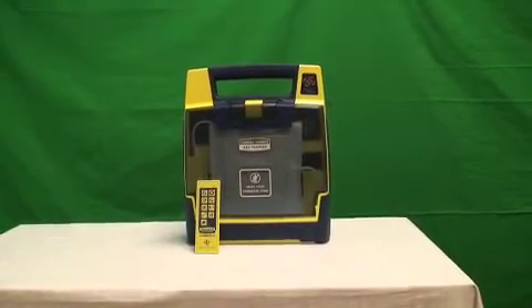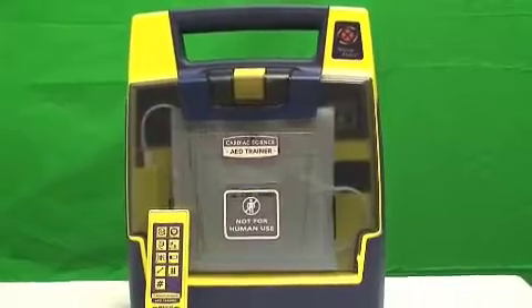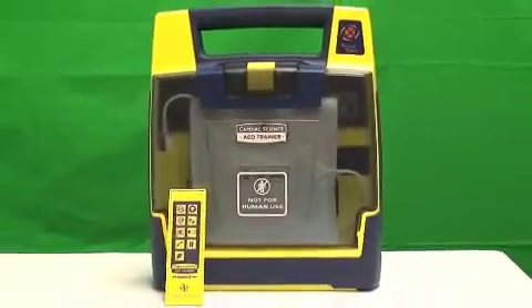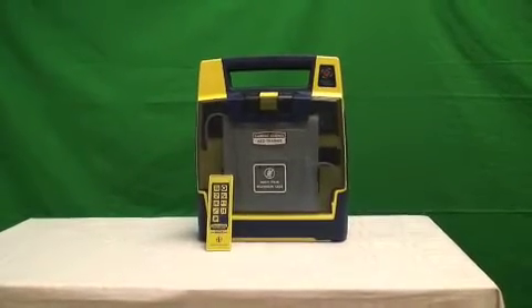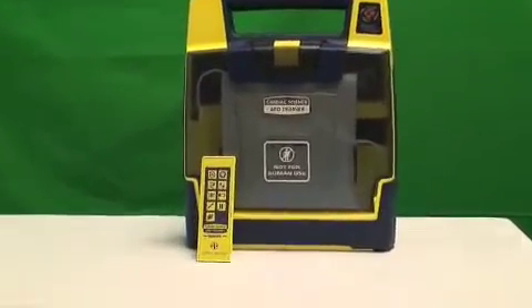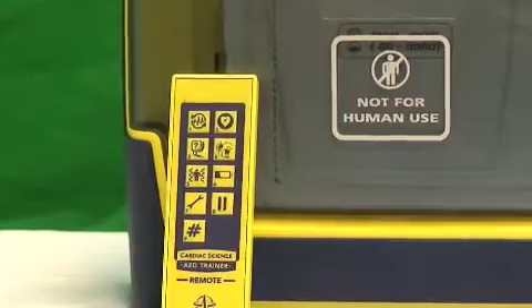DOCS is the only distributor for Cardiac Science that offers an AED training unit at no additional charge. The AED trainer is an exact replica of the G3 Plus unit. Through the use of remote control, you can practice with your team: opening of the pads, placement of the pads, and running through several different emergency scenarios. DOCS will let you borrow the AED trainer for one week.